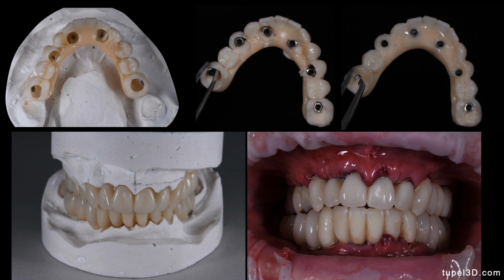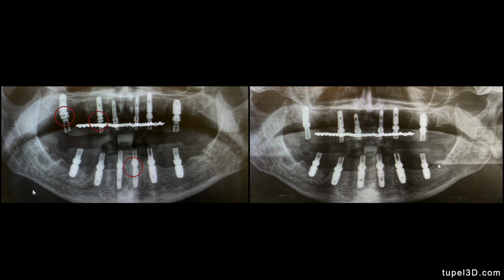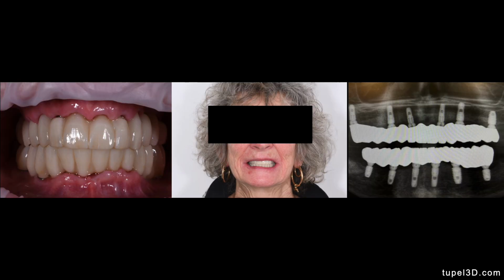we connect the titanium cylinders into the interim prosthesis, and you can imagine how fiddly and complex that is, and sometimes there's too much pressure on the soft tissue, which can cause misfit, as in this case, and it also takes a lot of time. I remember I fit these bridges around 10 in the evening, and after the X-ray I could see there was a misfit, so I had to remove the prosthesis, adjust the pontic and refit, and that's the case completed. So it is possible, but it is quite complex, and there's a lot of risk of complications.